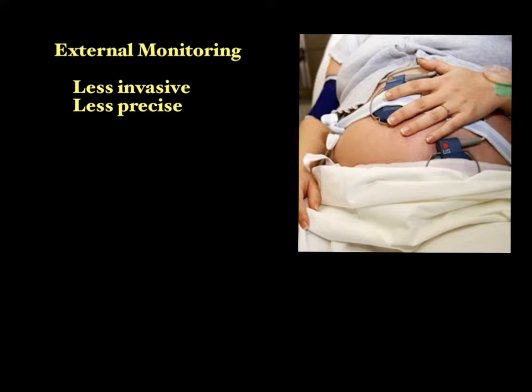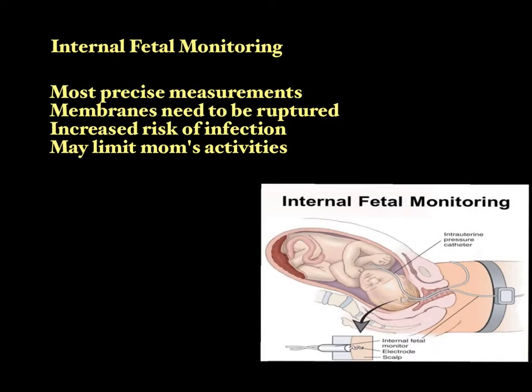And with contractions, you can measure the frequency and the duration of the contraction, but you cannot measure how intense it is. And we'll talk about that a little bit more. But that is an external monitor. Moving on to internal fetal monitoring, I have a picture down in the bottom right corner. This gives you the most precise measurements.